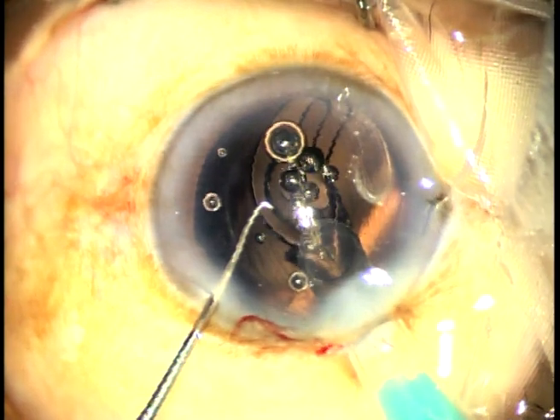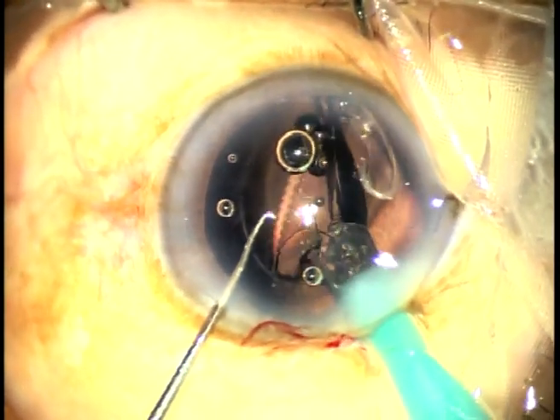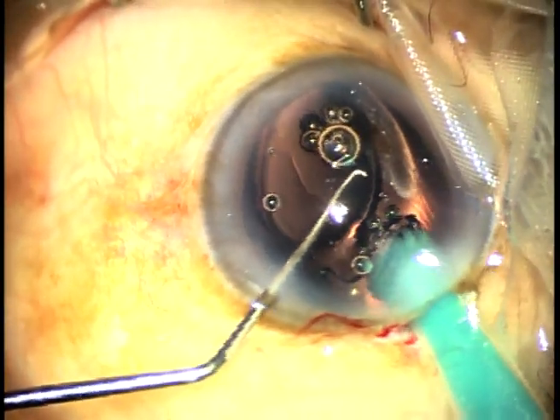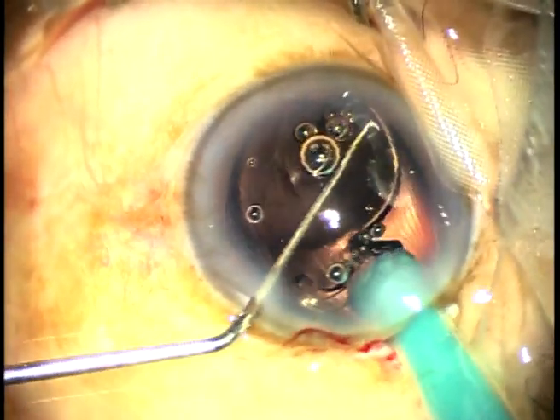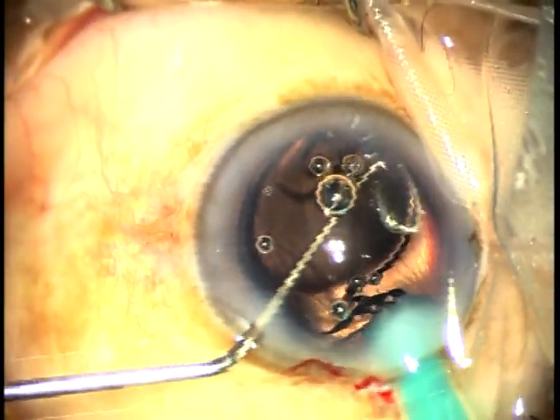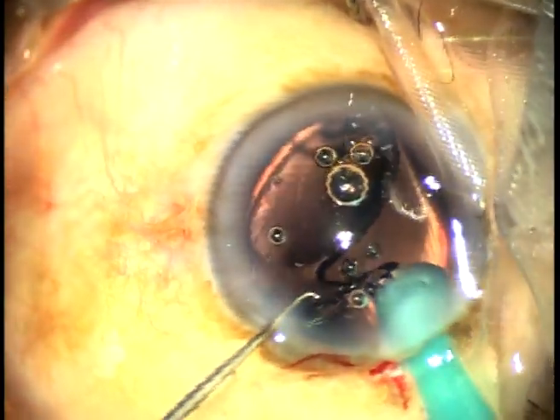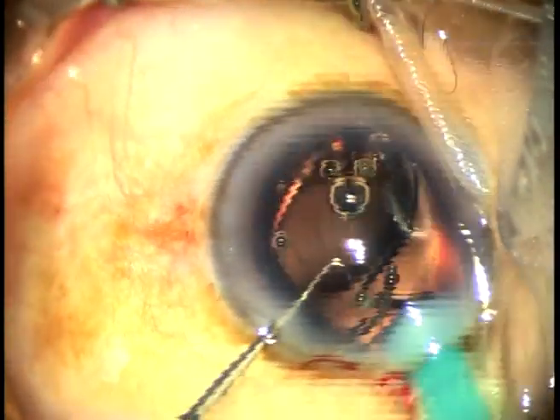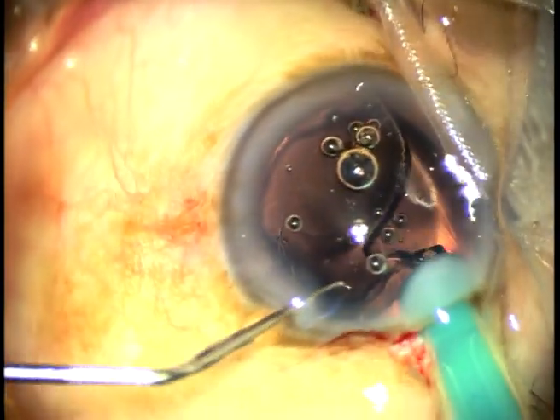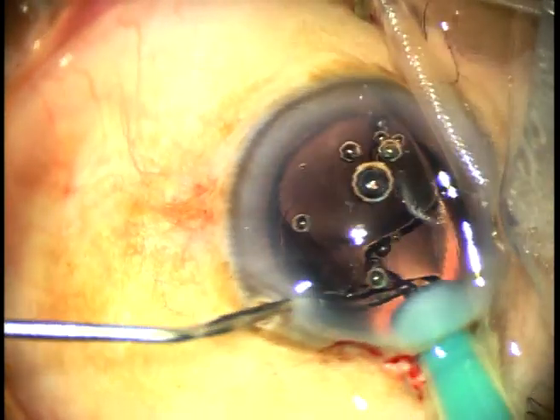In this case, the cortical clean-up has been done very nicely. The posterior capsule is intact at this moment. And now, a trainee is implanting the intraocular lens. At this moment, I was just talking to the nurse and I didn't look at the surgery.